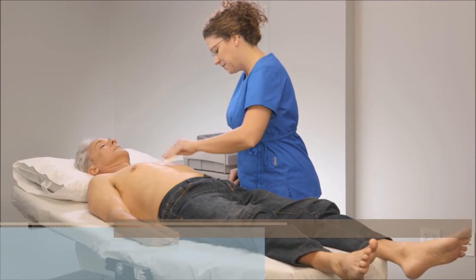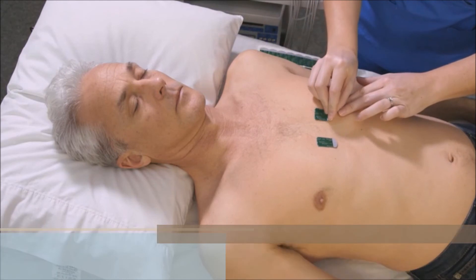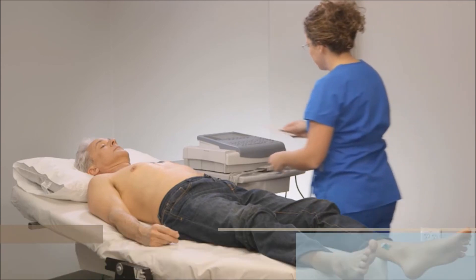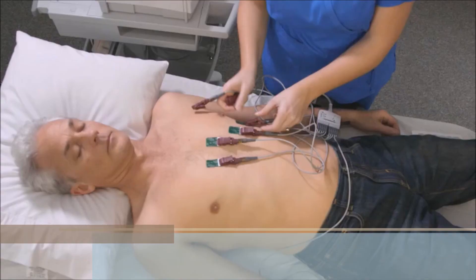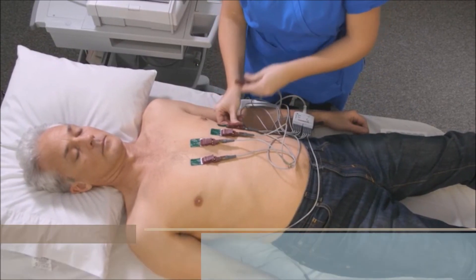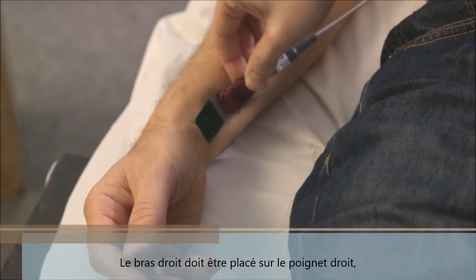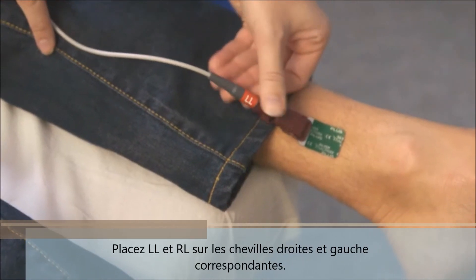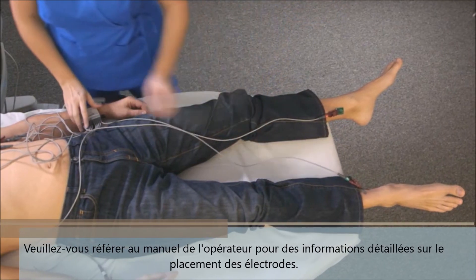Prior to placing leads, patient body hair must be removed to assure good contact. After hair removal, abrade the skin and cleanse with alcohol, then dry completely. Unplug unnecessary electrical equipment and place the electrodes in the following areas: V1 next to the sternum on the right side, V2 next to the sternum on the left side, V4 in the 5th intercostal space, V3 midway between V2 and V4, V5 next to V4, and V6 next to V5. The right arm lead goes on the right wrist, left arm on the left wrist. Place right leg and left leg leads on the corresponding right and left ankles. Please refer to the Operator's Manual for detailed information on lead placement.